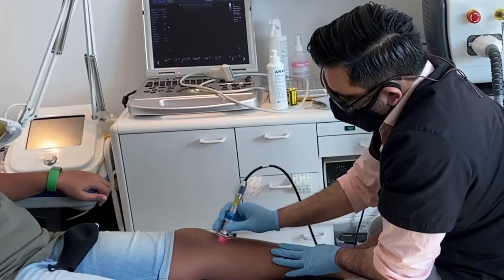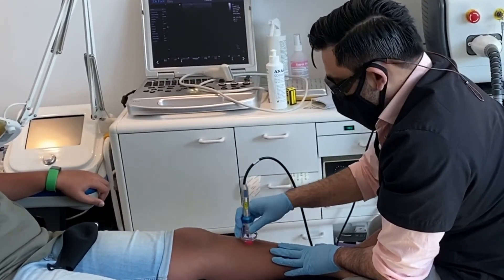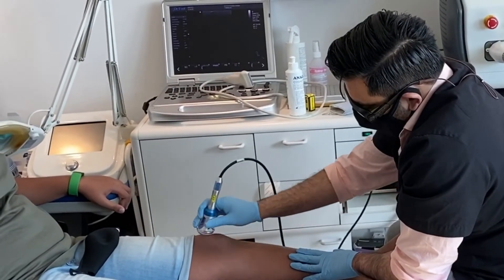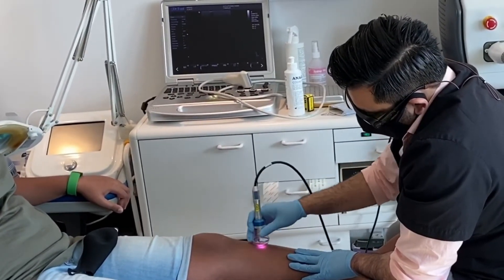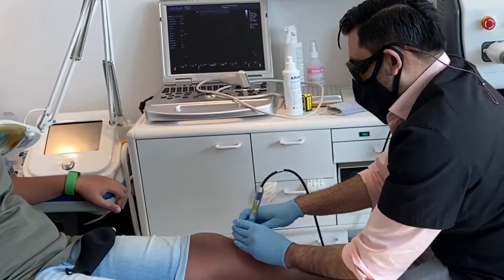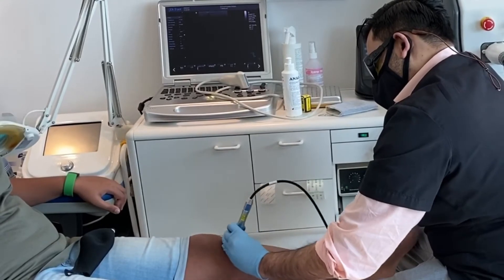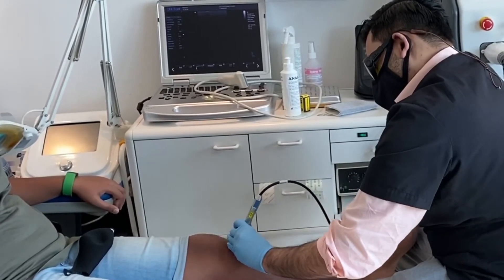So we're doing some class 4 laser running to ease the discomfort, along with rehab. It should reduce the discomfort slowly but surely. The rehabilitation is the primary intervention here.